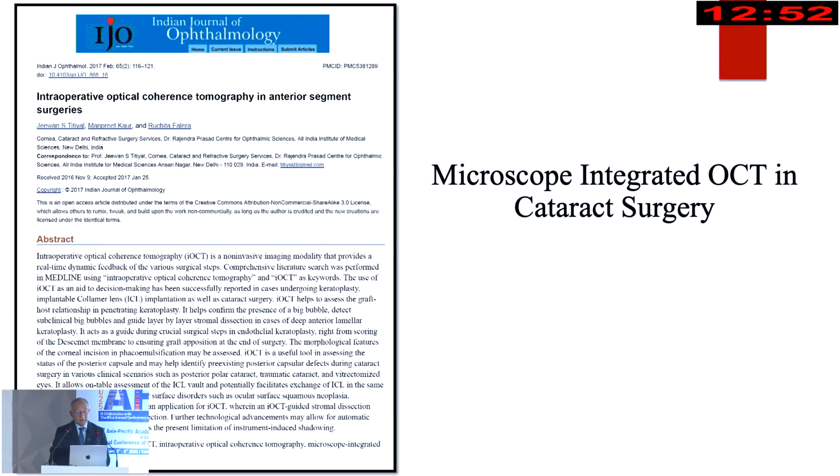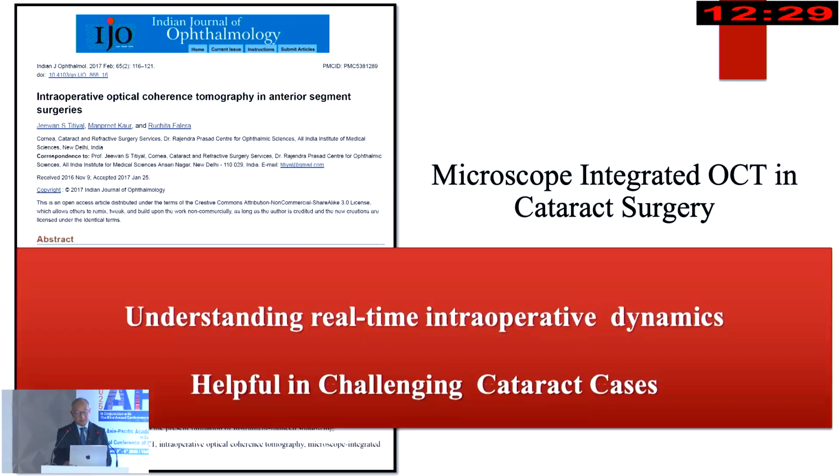This is our review article on microscope integrated OCT in cataract surgery. This was important at that stage because everybody was saying the iOCT microscope is meant only for retina people. So we shifted the concept that it is good for anterior segment surgery. In fact, now it is used more for anterior segment surgery than for posterior segment pathology also.